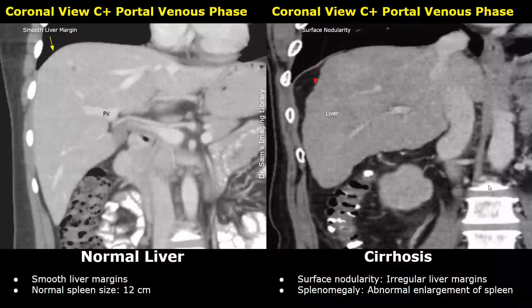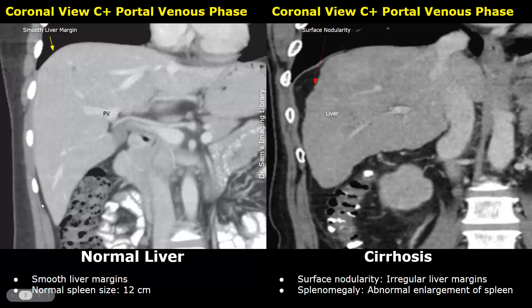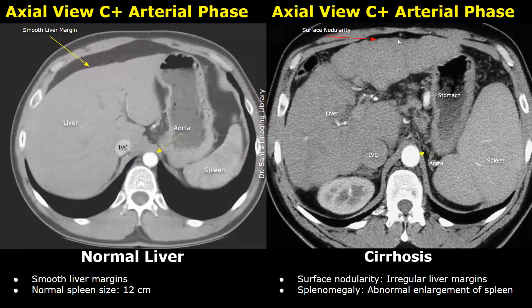These are coronal images of the normal liver and the cirrhotic liver. In the normal image the liver margins are smooth, whereas in the image on the right the liver has irregular margins, which is called surface nodularity. The liver also appears to be reduced in size. This is another case of liver cirrhosis — you can see even more surface nodularity and irregular liver margins in this case.